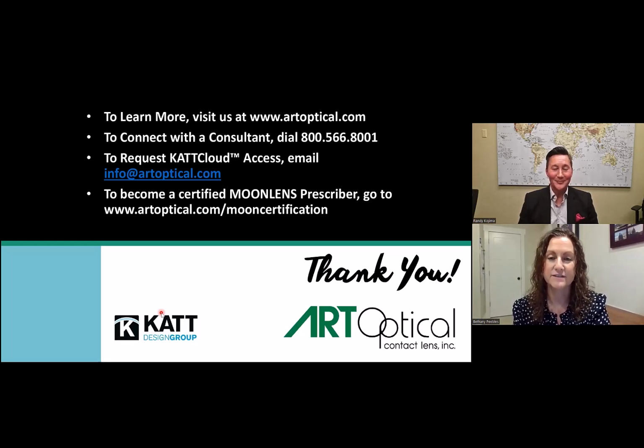Yeah, definitely. No, I thought it was great, Randy. And really, you keyed in on some important points, which is, right from the start, you mentioned getting good baseline topographies, taking the time to start off with good data. I love the part about being patient with your changes and not making changes too quickly. That is something that we talk about quite often with brand new orthokeratologists because there are a lot of things happening, a lot of moving parts with ortho-k.